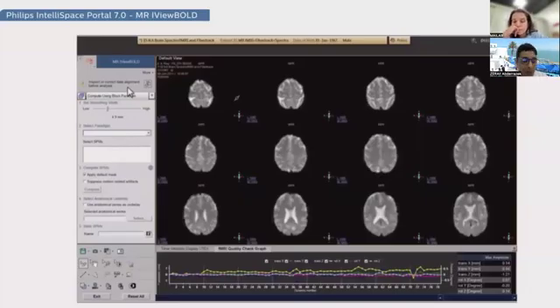For the other vendors, Siemens has also applied Deep Resolve Boost inside their machine to have a good temporal resolution and spatial resolution. Also the GE machine applied Sonic DL, especially in 2D. It was perfect in functional MRI. And for all the competitors today, they have their own deep learning and AI program to have a good temporal resolution and also spatial resolution.